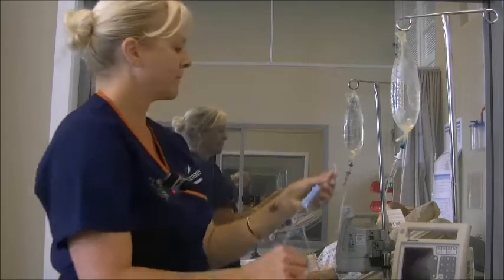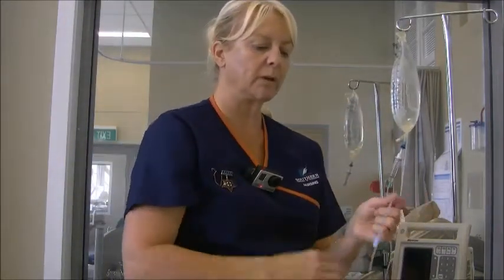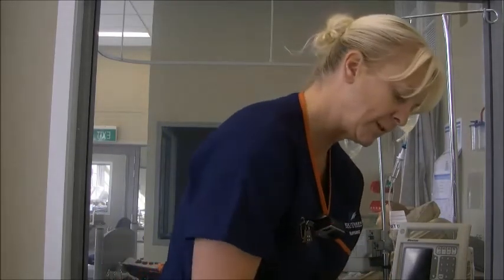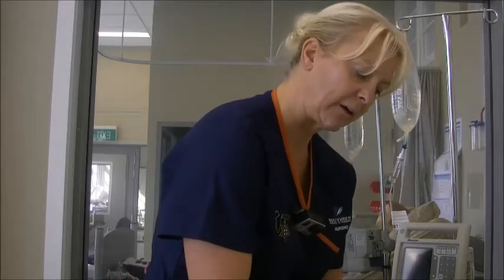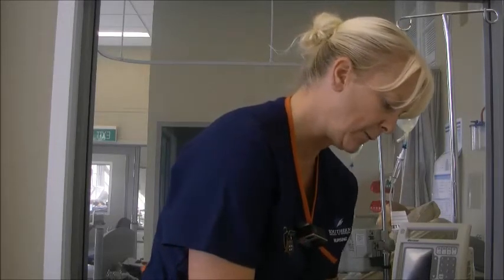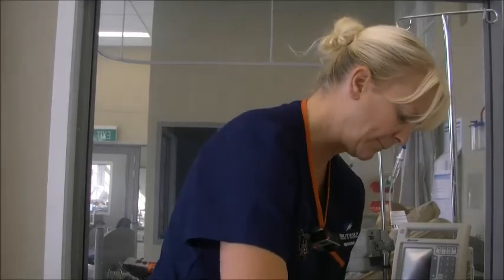And for the purposes of your assessment, when you come to connect, the first thing you're going to do is do a manual check of your IV. So now that I've got that ready to go, I'm just making sure that the clamp is off, and then I'm going to connect this up without touching anything.